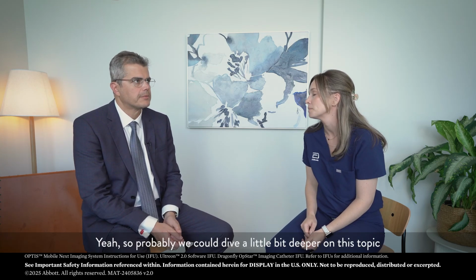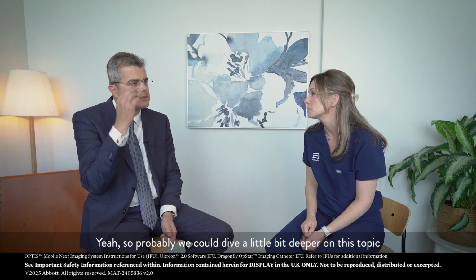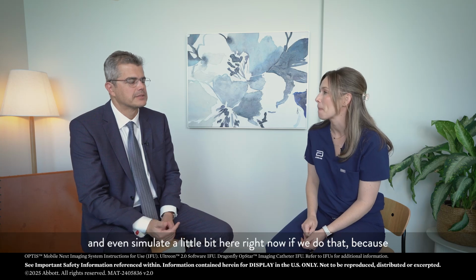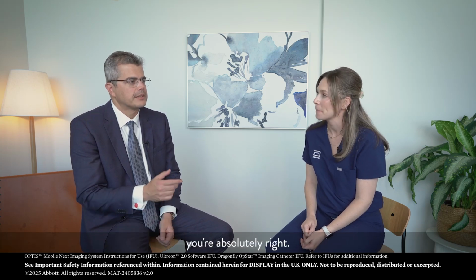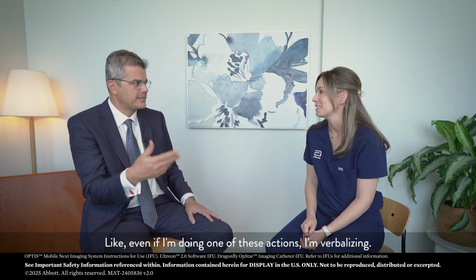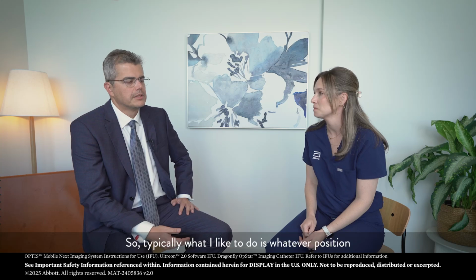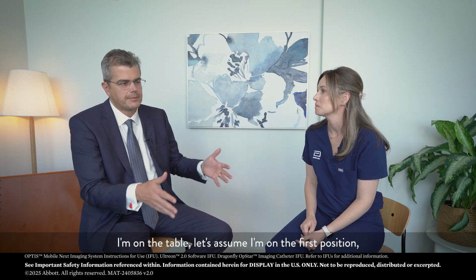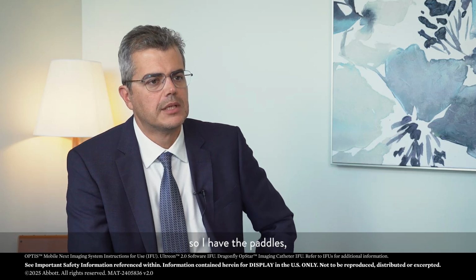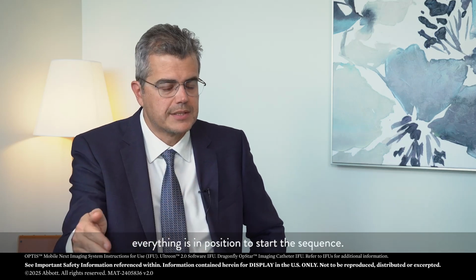Yeah, so probably we could dive a little bit deeper on this topic and even simulate a little bit here. Why don't we do that? Because you're absolutely right. Even if I'm doing one of these actions, I'm verbalizing. Yes. So typically what I like to do is, whatever position I'm on the table, let's assume I'm on the first position, I have the pedals, everything is in position to start the sequence.